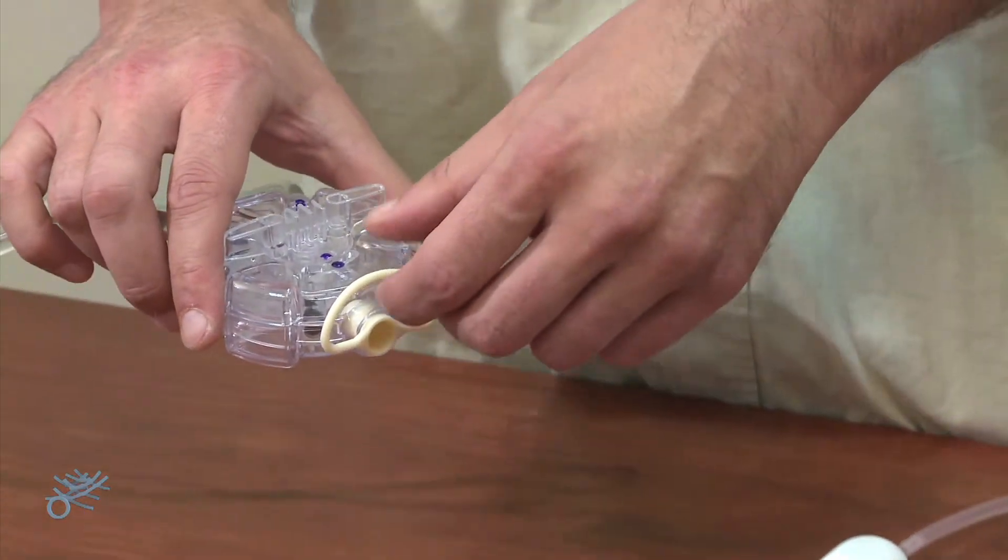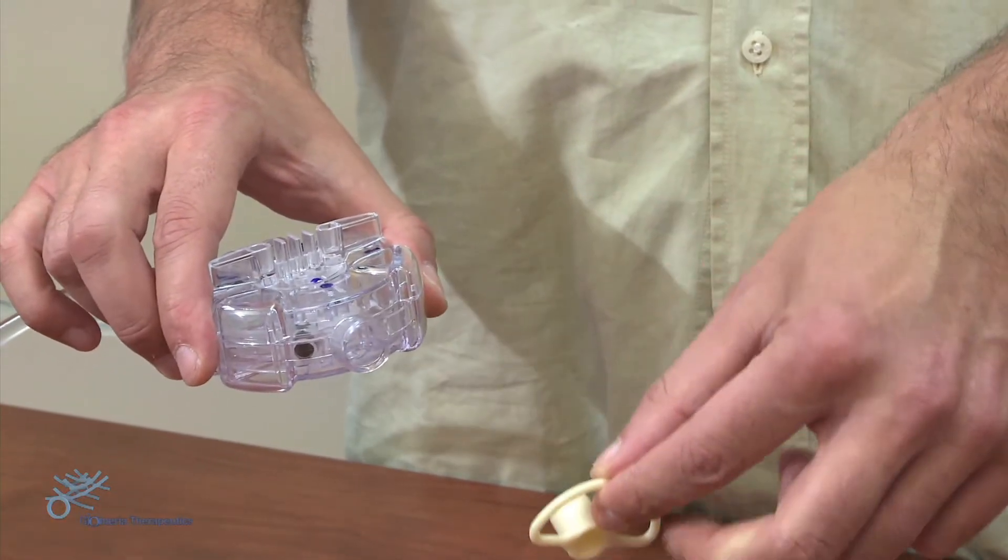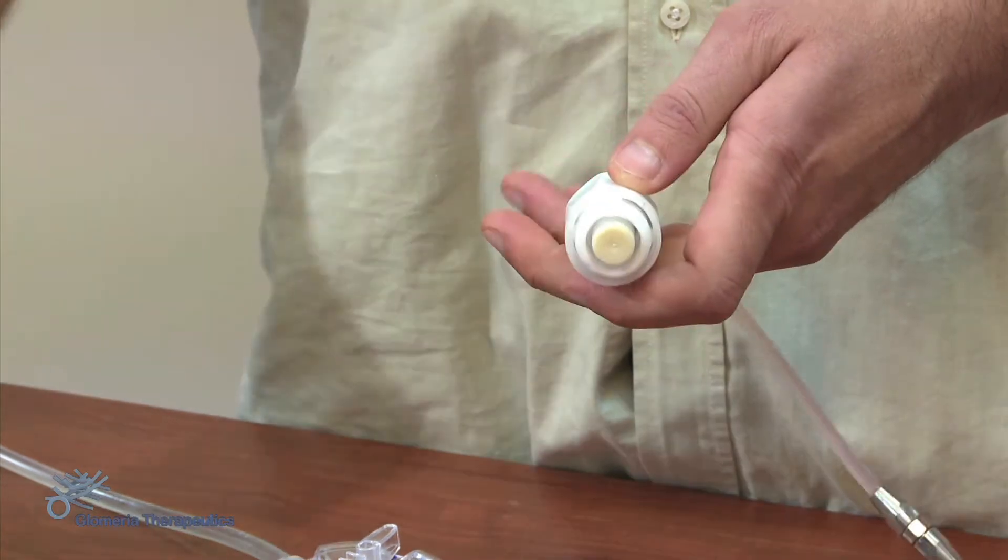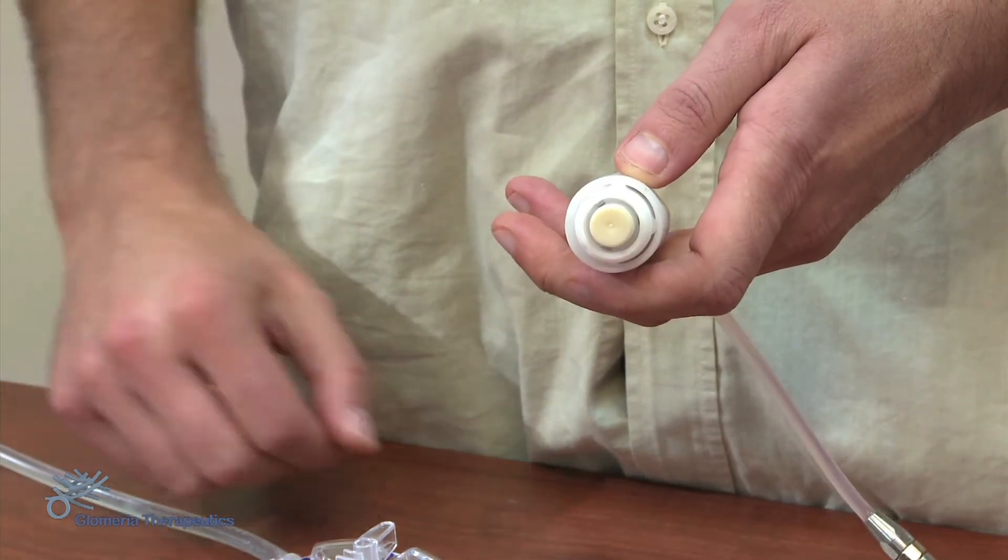We now pull the rubber ring on the protective cap on the Desmo connector. At this point, we unscrew the top of the Desmo patient set and place it on the counter.